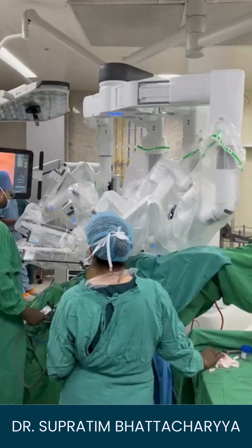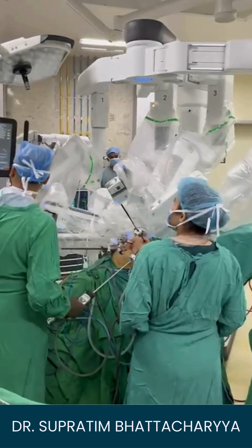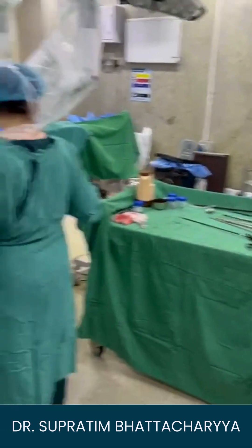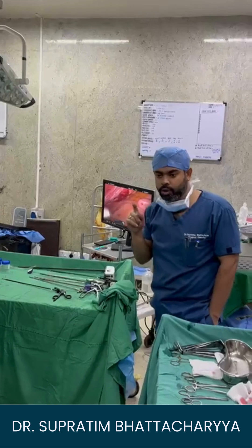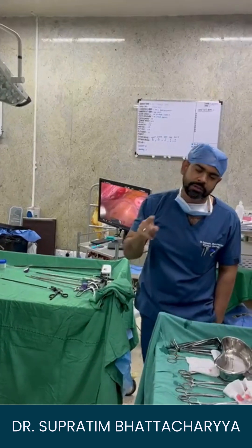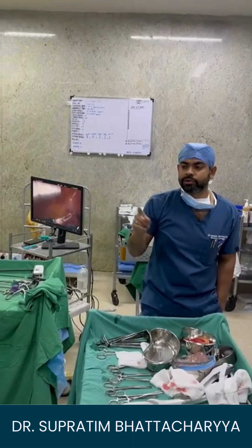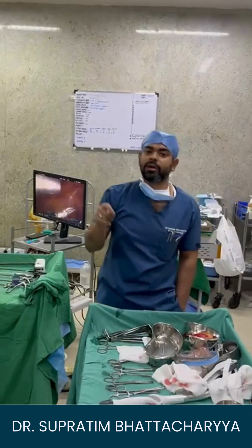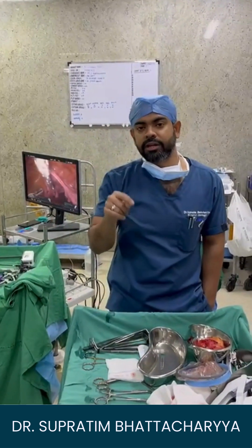These arms go inside the patient's abdomen. Depending on the kind of surgery you are doing, we either dock the arms inside the patient's abdomen or inside the patient's chest. For example, if we are doing a lung resection, we put the arms inside the patient's chest.